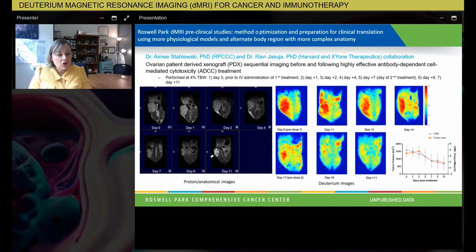You see it on their initial scan, and you start treating. A few weeks later, a few months later, you rescan them, and you want to see, did the tumor shrink? Well, it turns out in about 1/3 of the cancer patients, it looks like the tumor gets bigger, even if there's actually a response. So pseudoprogression is when you think the tumor has gotten larger, and therefore you're thinking it's progressing clinically, but in reality, it's actually responding.